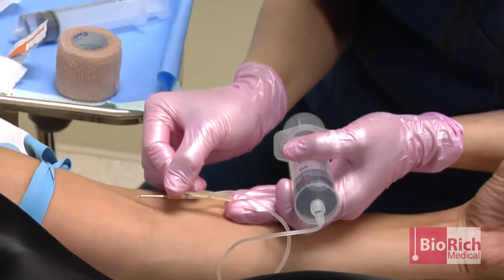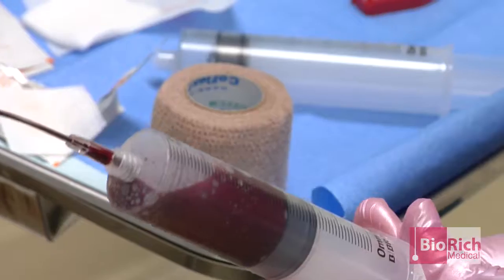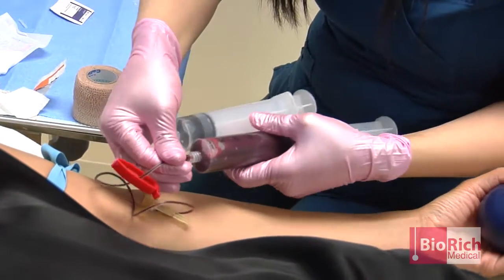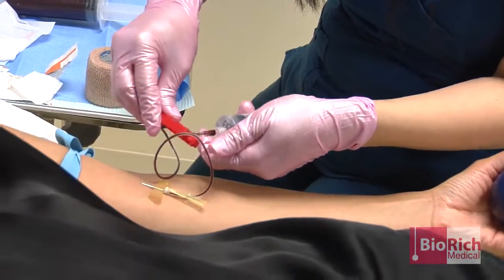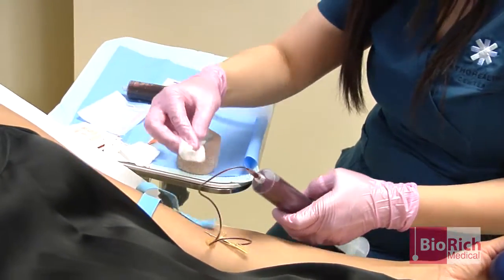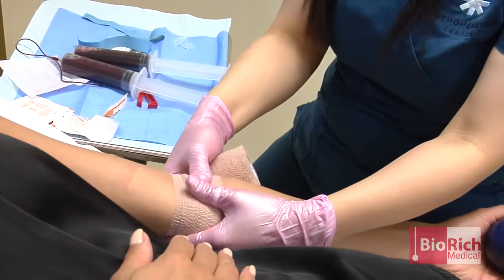Okay, here I go. Just take a deep breath. You don't need to — you have nice veins. Here you go. Take that off in about ten minutes, okay? Thank you. You did great.